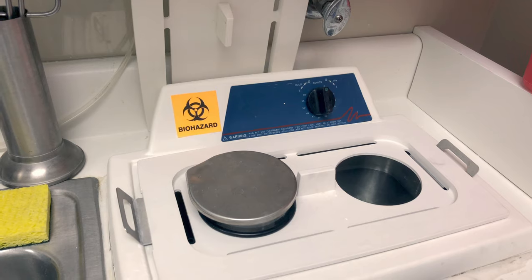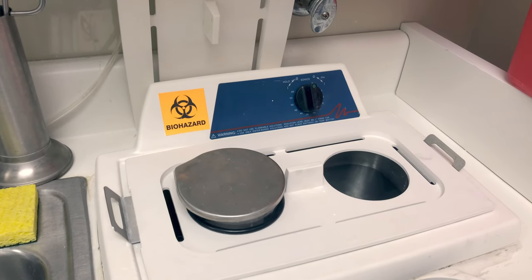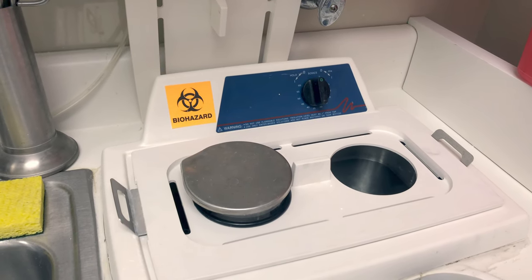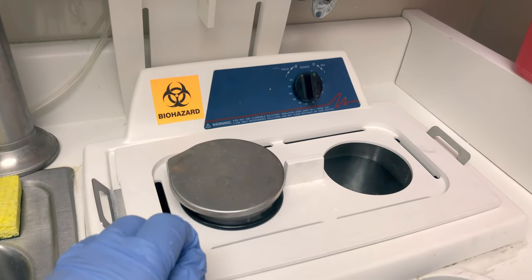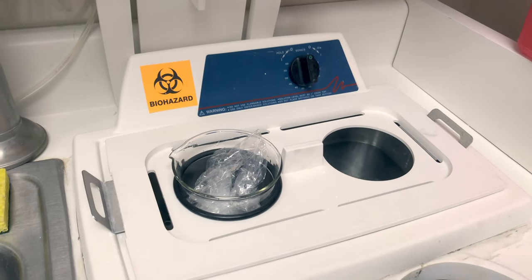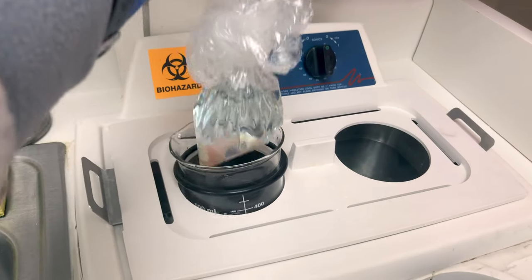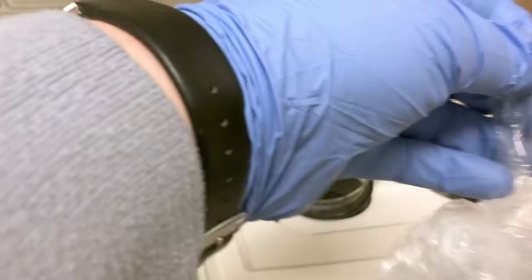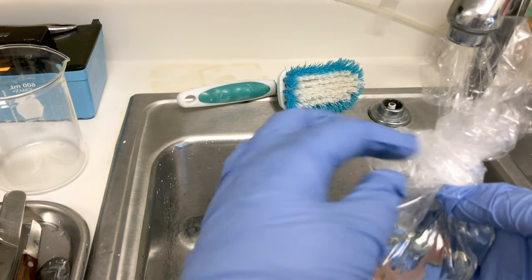When you're ready to remove your appliance, remember that the ultrasonic cleaner solution is dirty. With the beaker sitting in the solution, we cannot touch the beaker. Open the lid and remove the bag, keeping the beaker in that lid until you're ready to take care of it properly — rinse it and disinfect it so it can be used on the next person. We then need to remove the appliance from the bag.